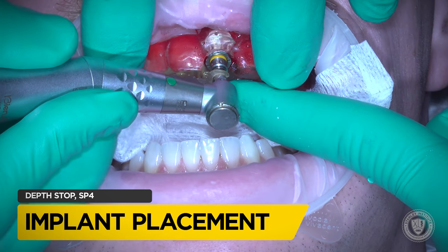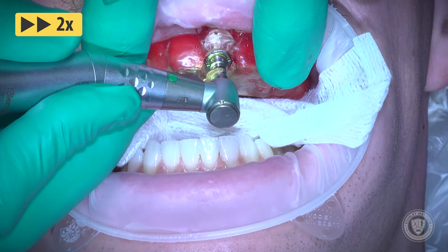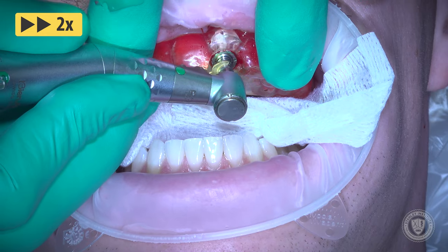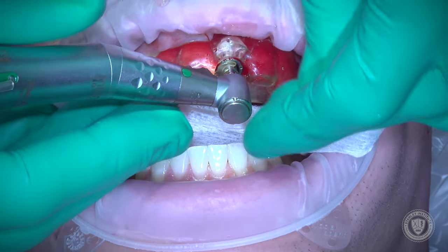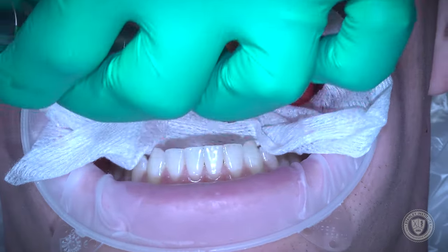We're coming in with our guided implant placement, fully guided. There's a little plastic snap link, and when that snap link touches the top of the master cylinder, that means we're down and at the proper depth.